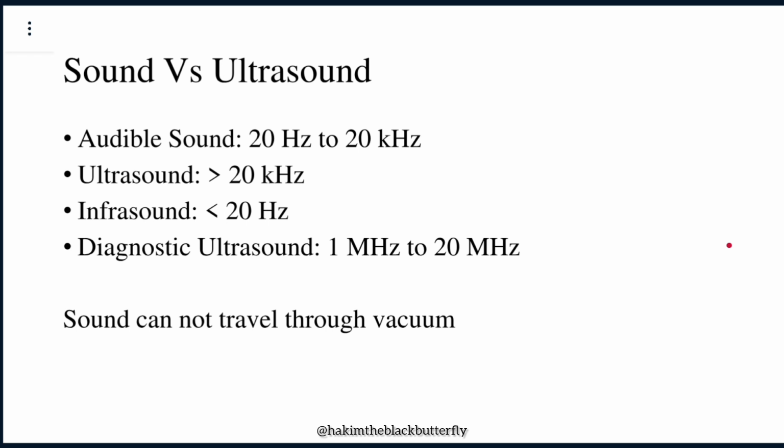Other animals which use ultrasound include the whales, the orcas, the dolphins. They all use ultrasound for communication and other things. And surprisingly, the way the ultrasound machine works, sending ultrasound beams into the body, getting back the echoes, and reconstructing images, is said to be the same way these animals use ultrasound. They send ultrasound beams, these beams get reflected from different obstacles and come back to the same animal. Then the brains of these animals interpret the echoes that come back, reconstruct what the obstacles are that reflected these echoes, and get to know what is where.